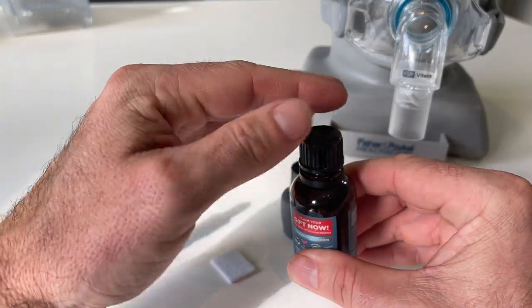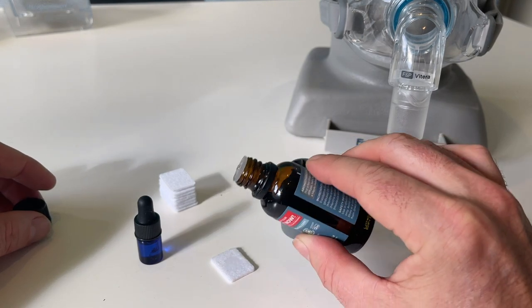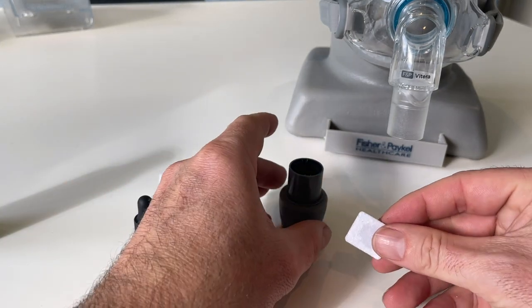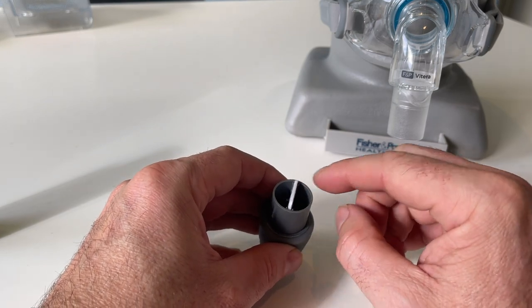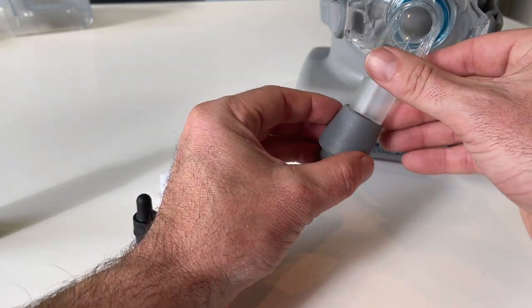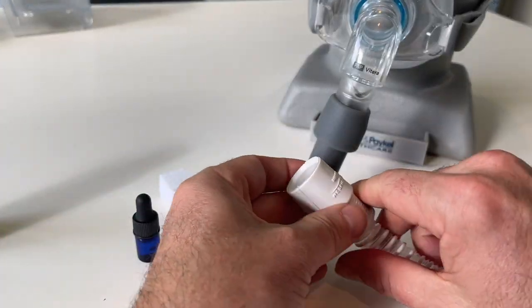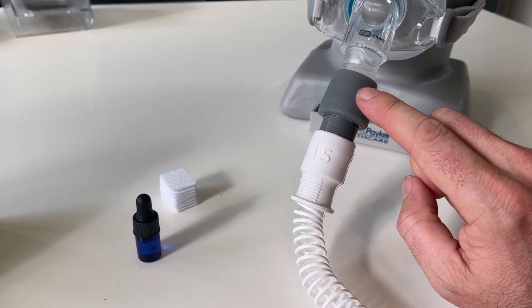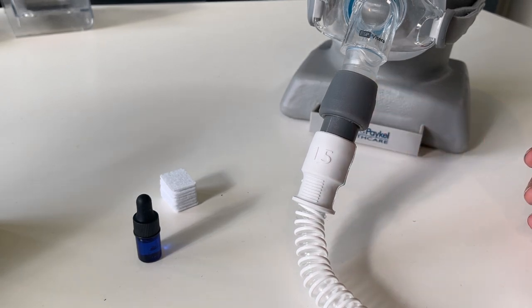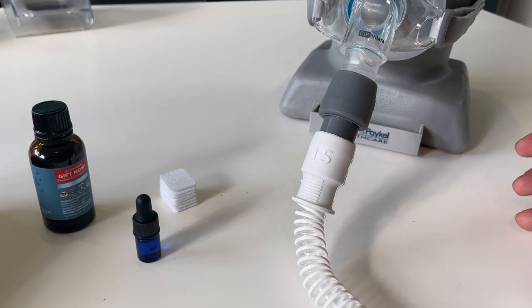All we do is put two or three drops — whatever suits you. The more you put on, the stronger it's gonna be. I'll put five on. Then your little filter pad just slots in here, so that filter pad holds all the oils. And then we just connect that up to our mask and then our tubing. And now we're good to go. That little adapter is now gonna provide a beautiful smell — it's a really lovely smell — and you can basically go out and get any smell that you like, put them on the filter pads, and away you go.